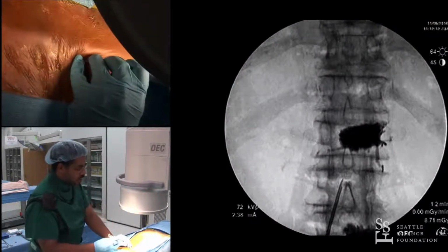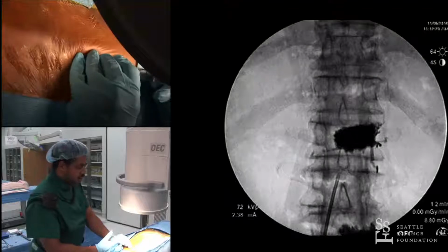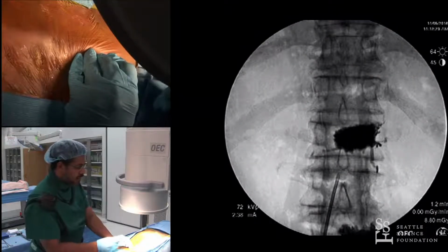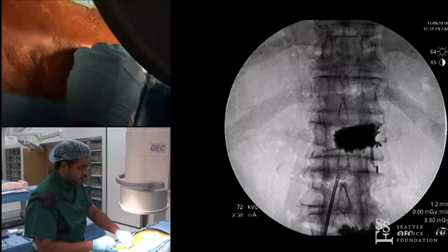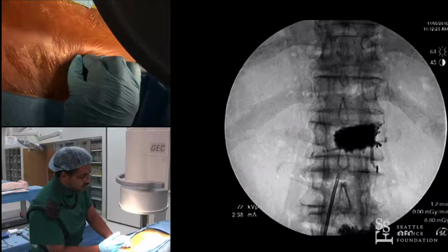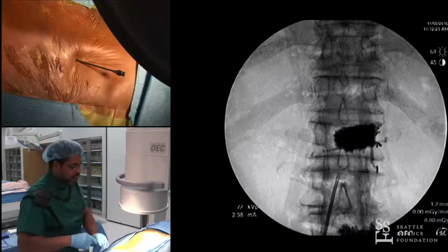We're tilted a little bit to the right there to... Tyler? There's a loss of resistance syringe. Good. Thank you.